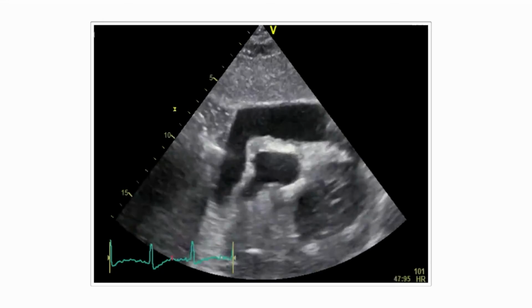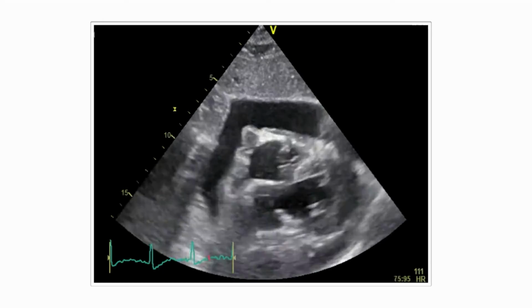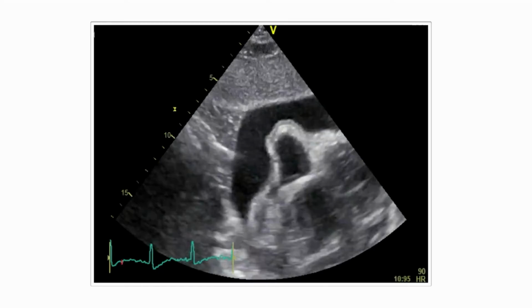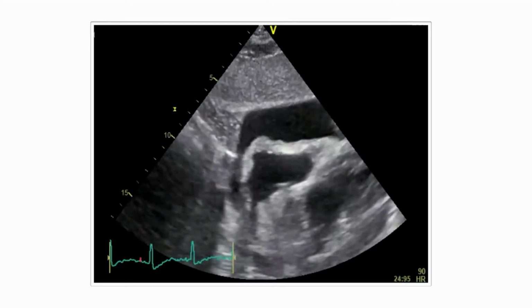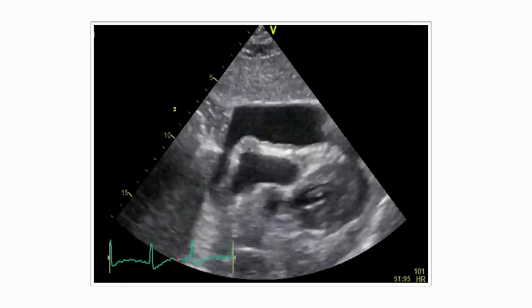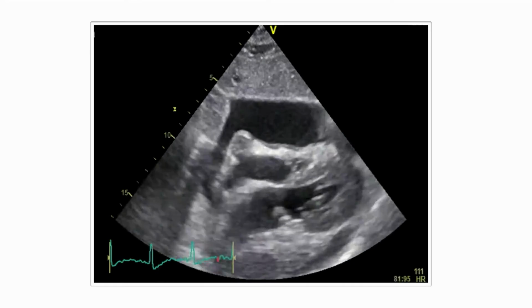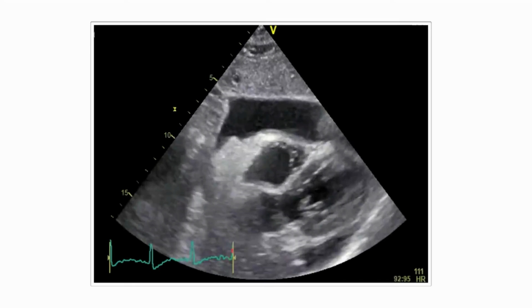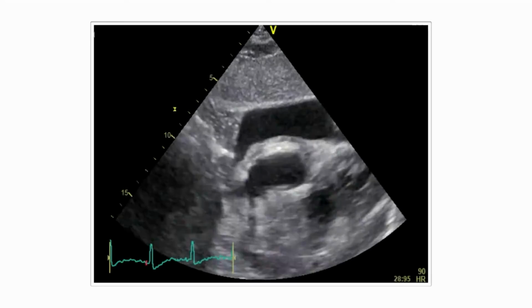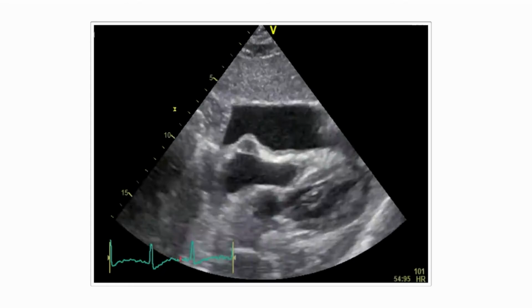And here, a patient who has a very large pericardial effusion, which is hemodynamically significant. You see that there is compression of the right ventricle, that the right atrial wall is kind of collapsing inwards, and probably a pericardial effusion that was, I would say, developing over a certain time, at least days, I would say. Nevertheless, you see many of the signs that are typical for tamponade, such as even, I would say, compression of the left ventricle.